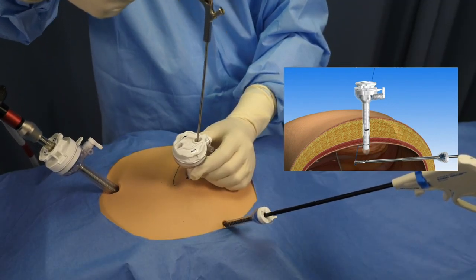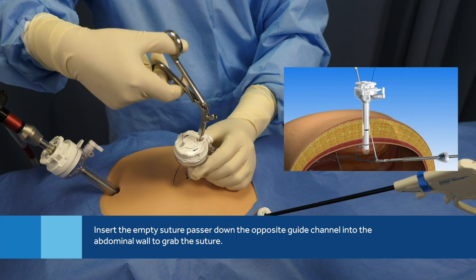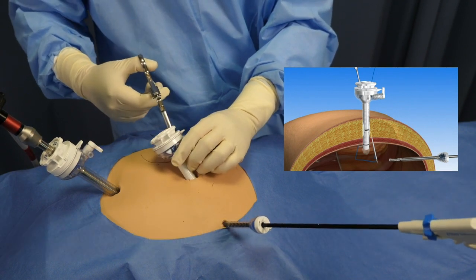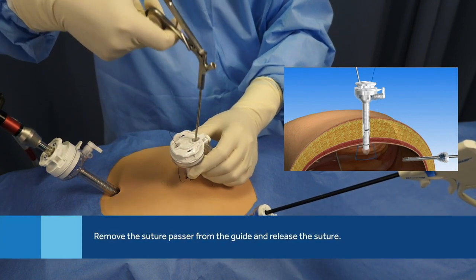Use a grasper to secure the suture before removing the suture passer while holding the cannula in place. Keep hold of the cannula to ensure it's still lined up with the peritoneum. Insert the empty suture passer down the opposite guide channel and into the abdominal cavity. Using the grasper, place the suture into the jaws of the suture passer.